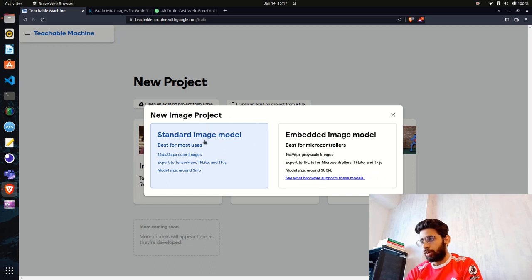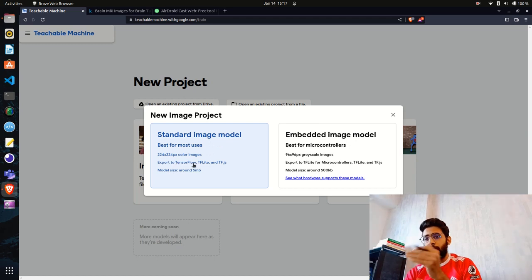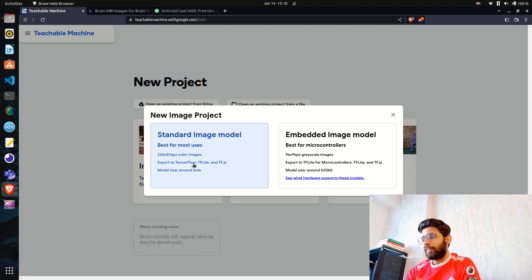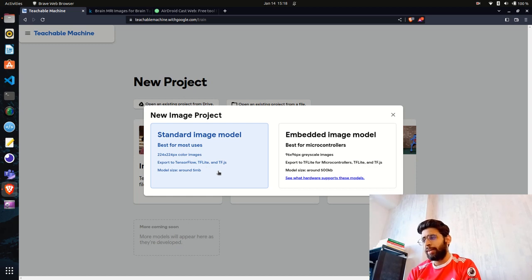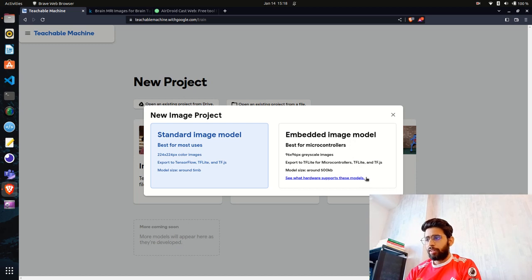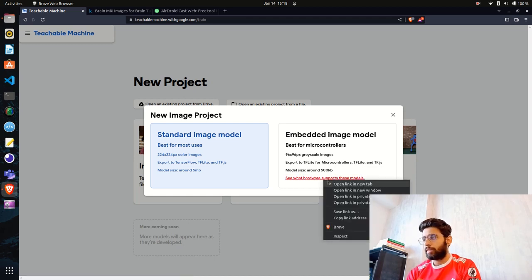The two options are Standard Image Model and Embedded Image Model. We're going to use the Standard Image Model. You can export the trained model to TensorFlow, TF Lite, or TF.js, and the model size is also reduced through quantization. The Embedded Image Model is more for microcontrollers like Arduino using TinyML.